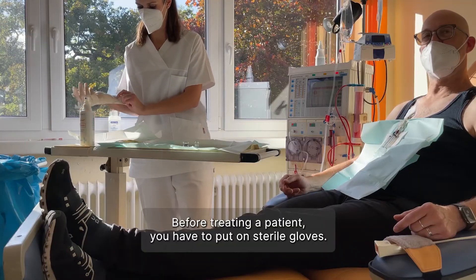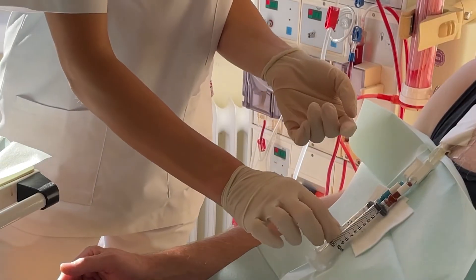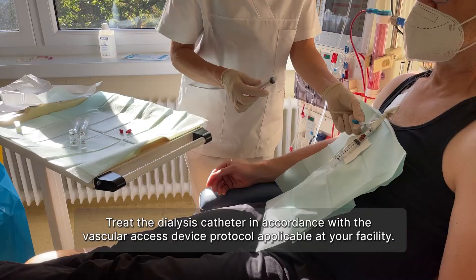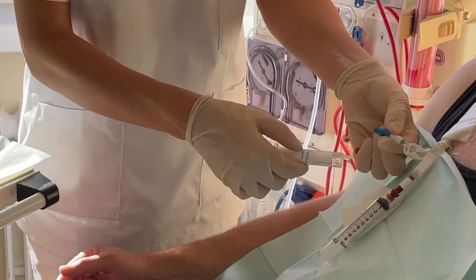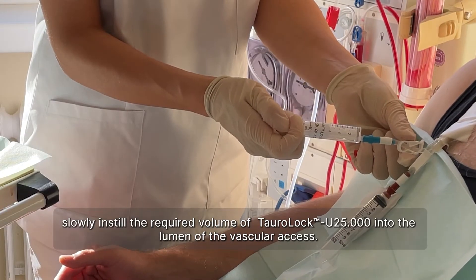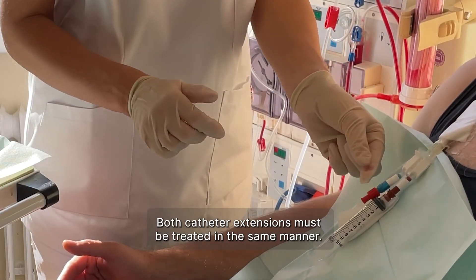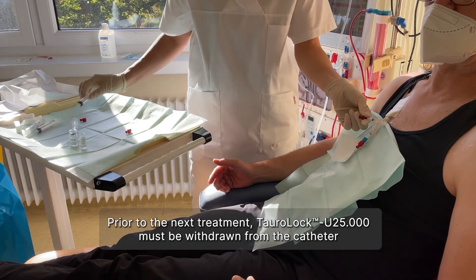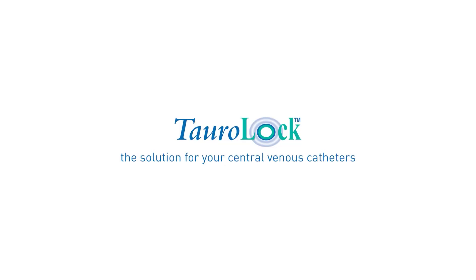Before treating a patient, you have to put on sterile gloves. Treat the dialysis catheter in accordance with the vascular access device protocol applicable at your facility. For an effective prophylaxis against infections and occlusions, slowly instill the required volume of ToroLoc urokinase into the lumen of the vascular access. Both catheter extensions must be treated in the same manner. Prior to the next treatment, ToroLoc urokinase must be withdrawn from the catheter and discarded according to the regulations applicable at your facility.